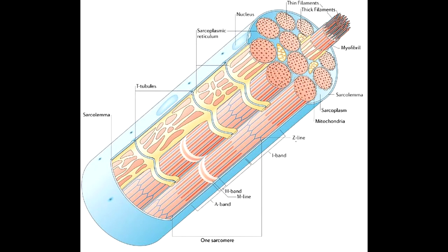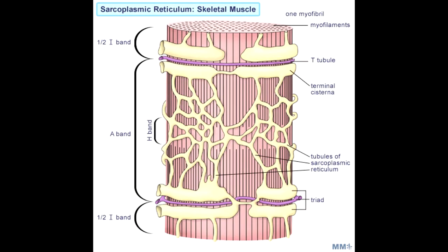The muscle fibers have a specialized endoplasmic reticulum called sarcoplasmic reticulum. This stores calcium within the muscle, which is used during muscle contraction. The cell membrane of muscle, or as it's also known sarcolemma, has specialized invaginations into the cell known as transverse tubules. These convey the depolarization to the sarcoplasmic reticulum within the cell. This arrangement of transverse tubule and sarcoplasmic reticulum is known as the triad.